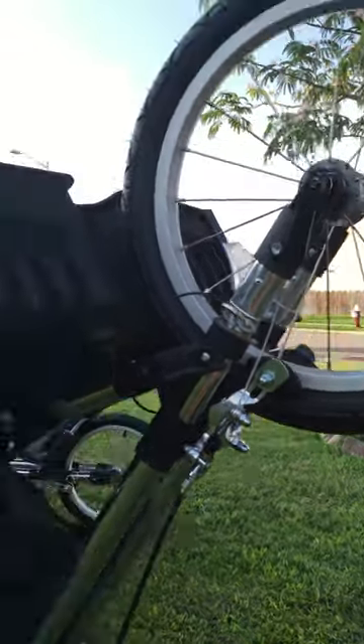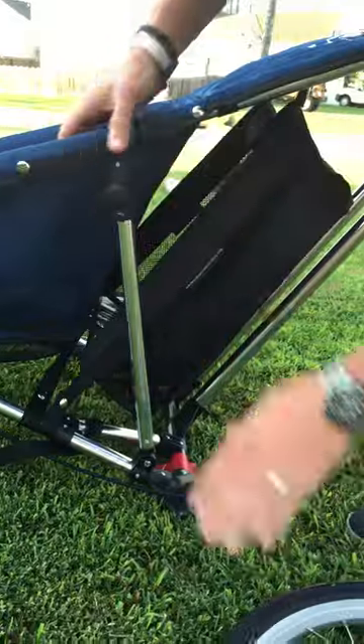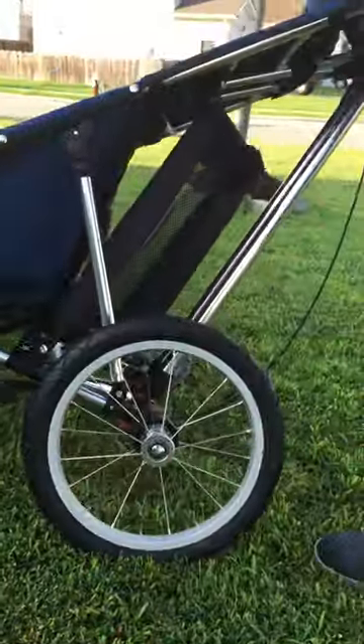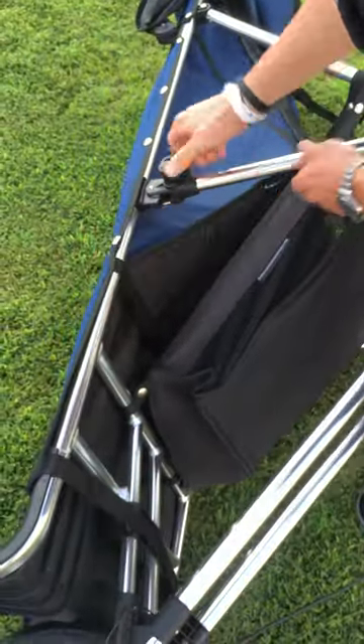Now we'll come to the side. We're just going to take this side bar, pull the frame up, push in the clip. Flip, and done. Other side, same thing — just coming right down to the side here, push in the hole, flip it up there.